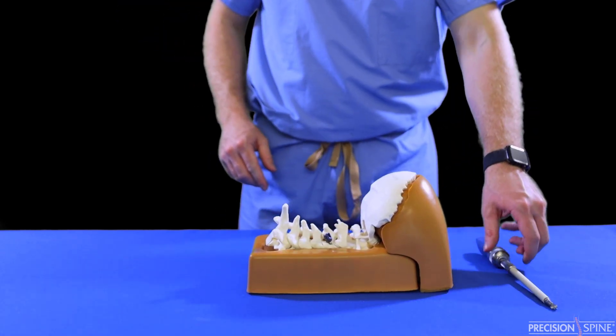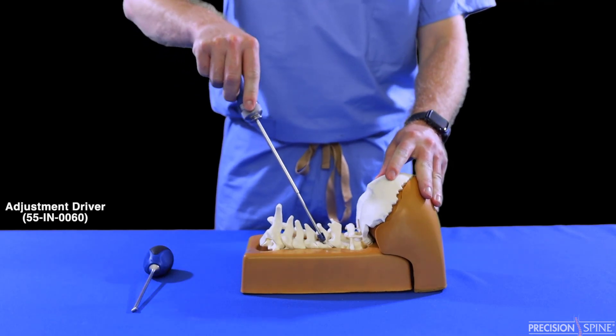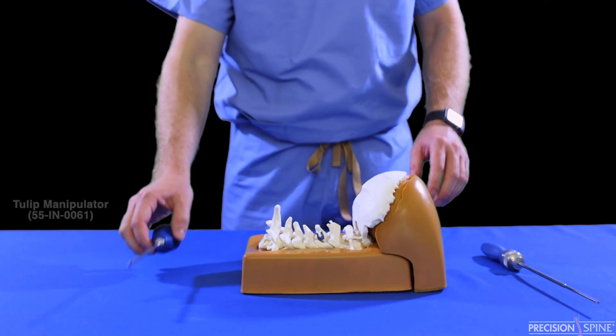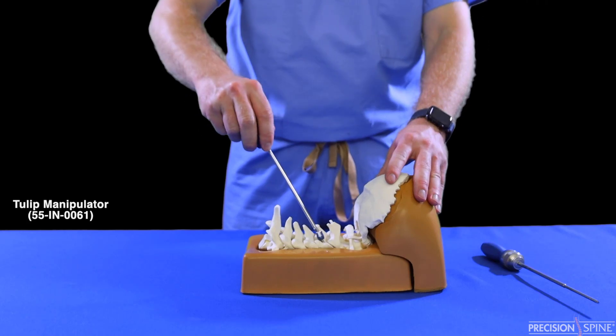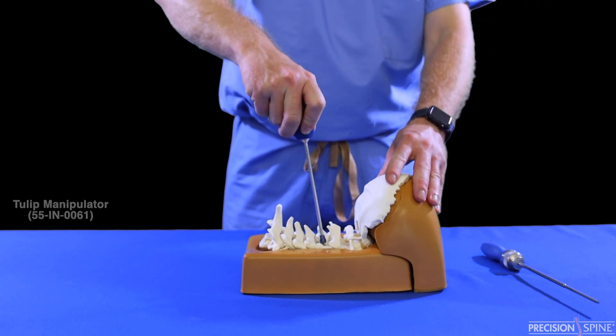Proper assembly is confirmed by the crossbar being flush in the tulip. Once the screw is placed, the height can be adjusted with the adjustment driver. The tulip heads can be lined up to receive the rod using the tulip manipulator.